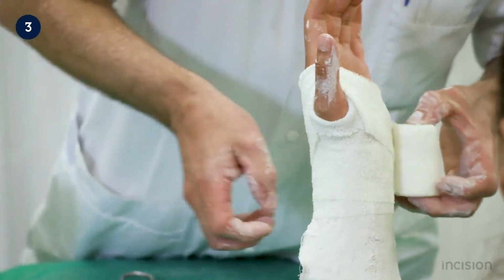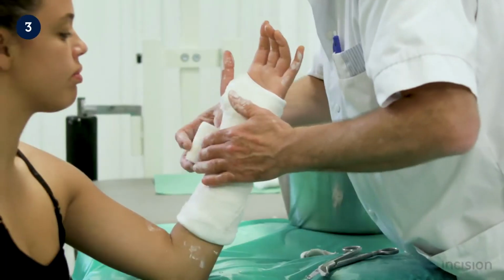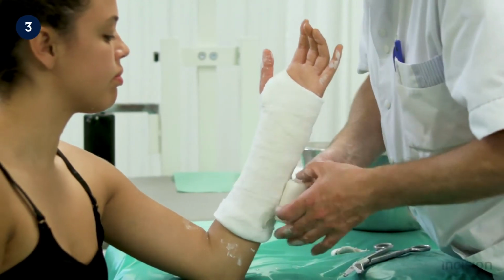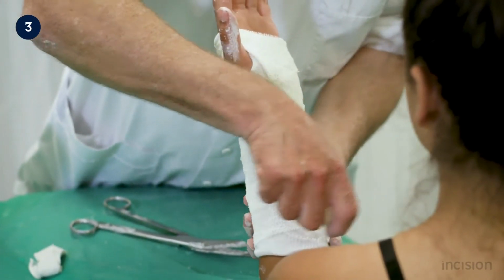Although application of the elastic wrap is done under tension, care is taken not to put too much tension on it, as this may compromise blood flow in the digits. The elastic wrap is applied to the entire length of the forearm, as shown.